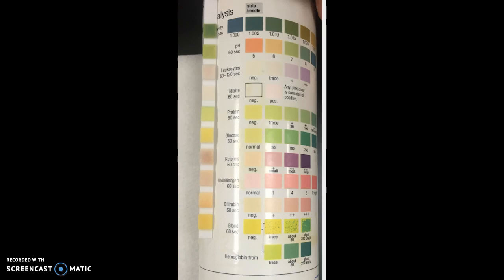So if you're starting at the bottom of the pad, right here, you would compare it to any one of these boxes, and if there's any color, then you would write down how much it matches with. So the orientation of the strip is vertical to the container, and each strip then gets assessed based on the horizontal line. So in this case, it would be negative for blood.